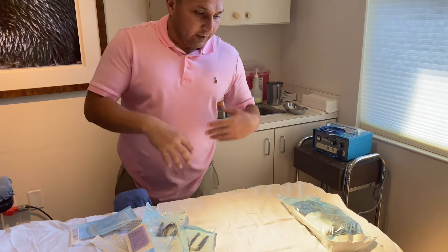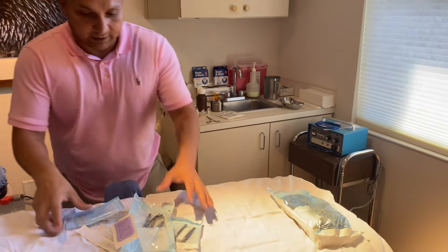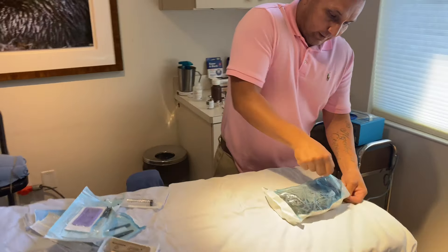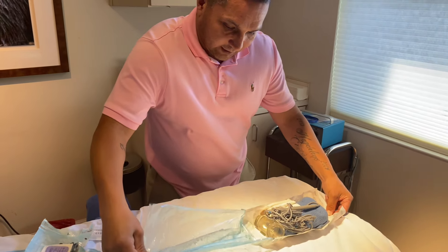If you set it up the day of and you contaminate it, you can re-sterilize it — it wouldn't be an issue. But I usually set them up the day of, and again, we're still keeping a sterile field. Always sterile.